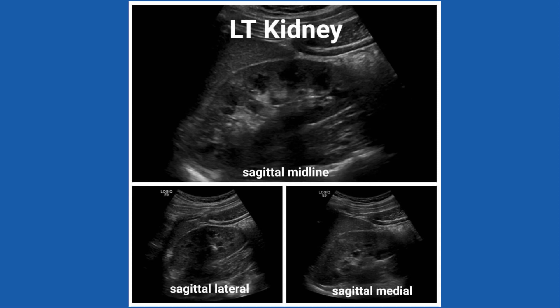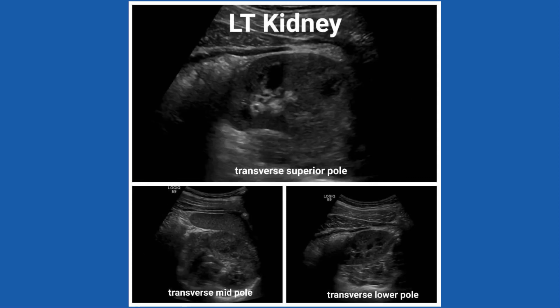Move on to the left kidney and complete the same steps you did for the right side: sagittal midline, lateral, medial — measure. Continue on to transverse and repeat the steps from the right: superior, mid, and inferior poles, with measurements at the transverse mid-pole portion. Always look for pathology — that's literally your job.